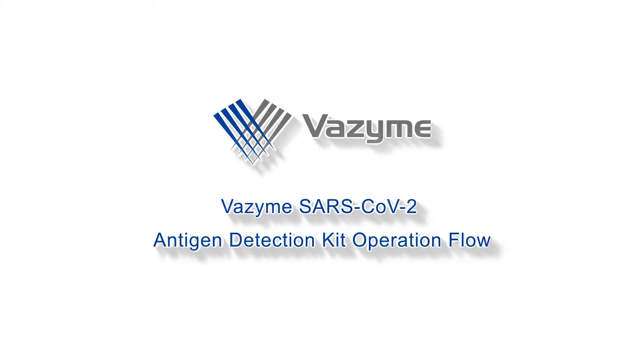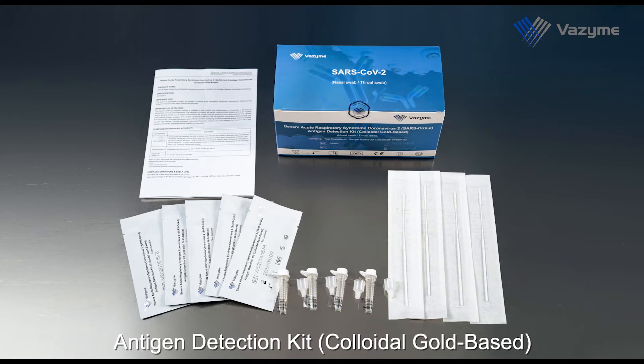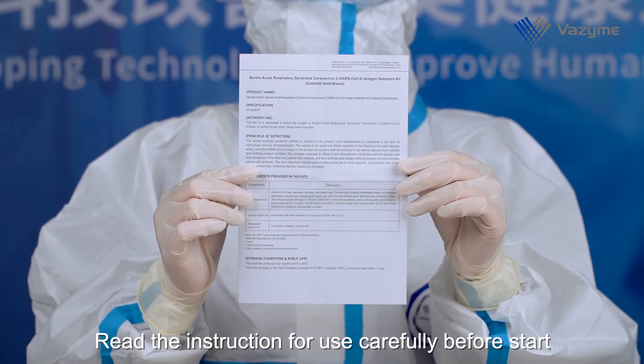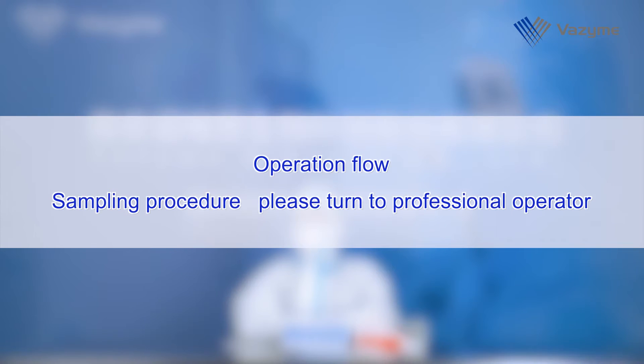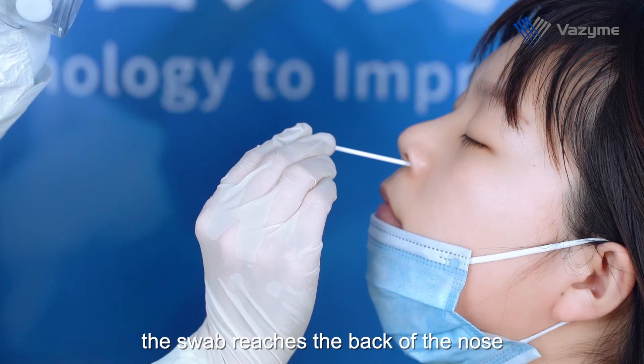SARS-CoV-2 antigen detection kit operation flow. Severe acute respiratory syndrome coronavirus 2 (SARS-CoV-2) antigen detection kit. Read the instruction for use carefully before starting.